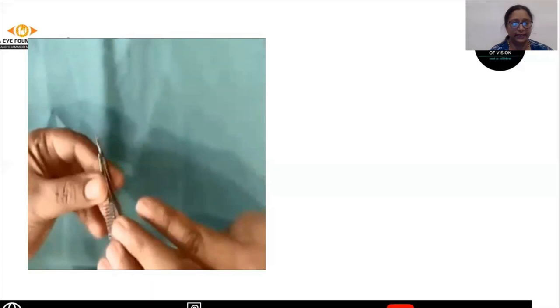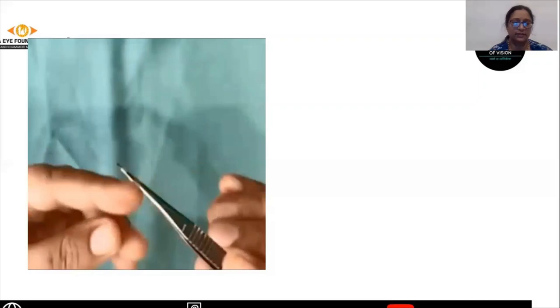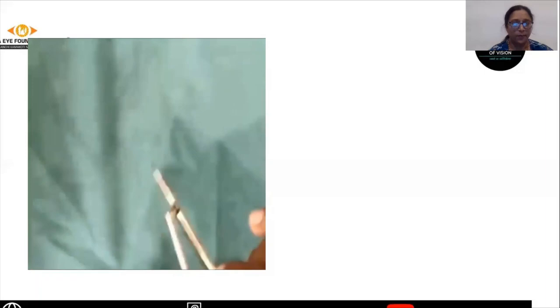In the next step, we do the ostium or sclerostomy. We use a Kelly punch. This is how the Kelly punch looks like. It has a punching mechanism with which a bite of the sclera can be cut.